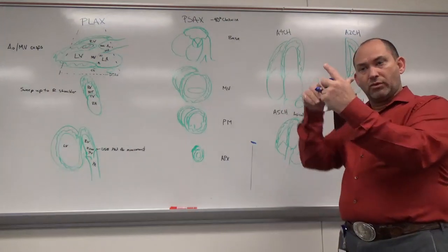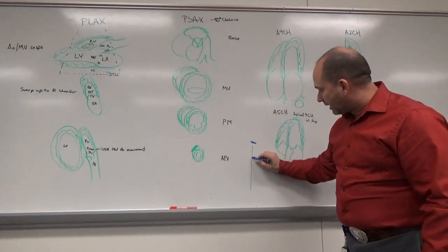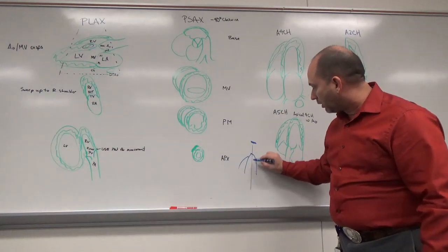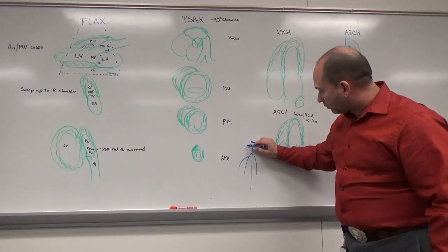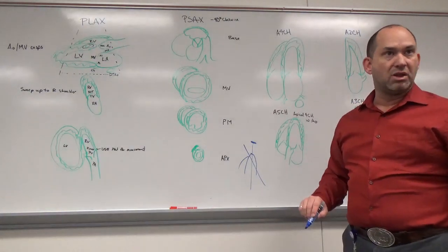Everything else is going to be moving, and what's in the center is going to be staying, hopefully. So whatever you want to line up, whether it be a 4-chamber view, and I want to go to a 2-chamber, when I turn this, I want it straight down the middle. If I've got my line coming through at an angle like this, am I going to get a good 2-chamber when I turn it? No.